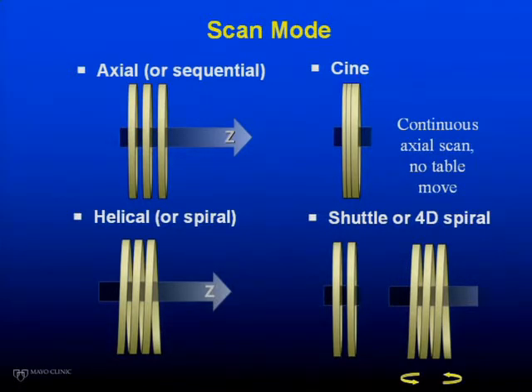And also for some head scans, because the image quality is demonstrated to be better than the helical scan in some head exams.